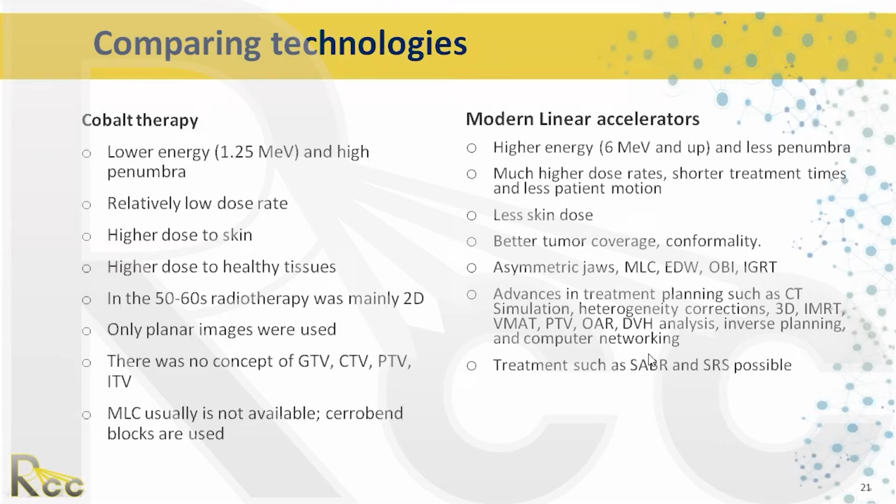In these treatments, instead of the patient being treated for a week or 2 weeks or 3 weeks, the patient is only treated in 4 or 5 fractions with very high dose. You can do that with a linear accelerator because the doses are so high. You can give a lot fewer fractions with higher dose, and that's called stereotactic treatments. And if you gave the treatment all in one dose, say to a tumor in the brain, that's called radiosurgery.